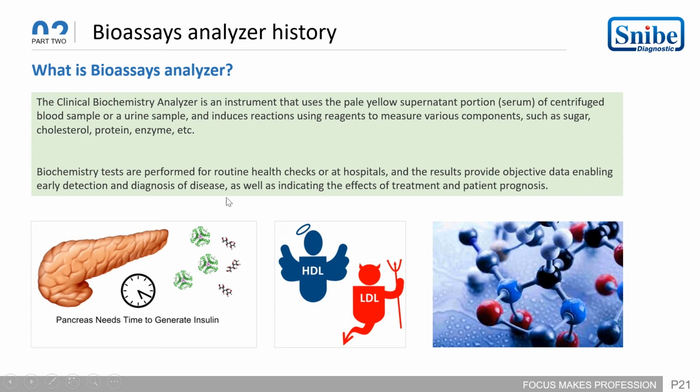Biochemistry tests are performed for routine health checks or at hospitals, and the results provide objective data enabling early detection and diagnosis of disease, as well as indicating the effects of treatment and patient prognosis.